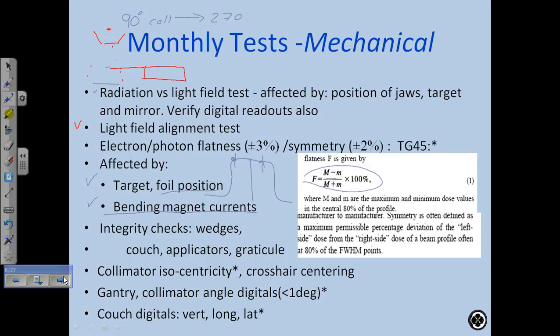Obviously, that's bad, right? Especially if you're doing IGRT to set up patients, and you think you got them right on, and the patient fidgets, and the whole couch moves. Your IGRT setup is off. Okay, couch applicators, so electron applicators, make sure, again, everything's nice and tight.